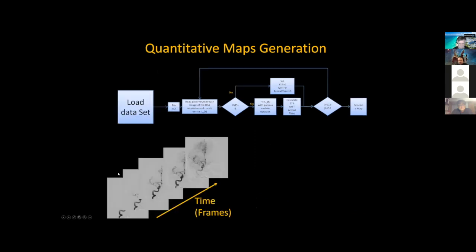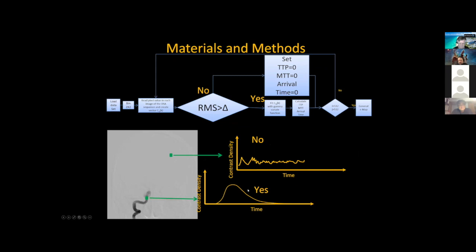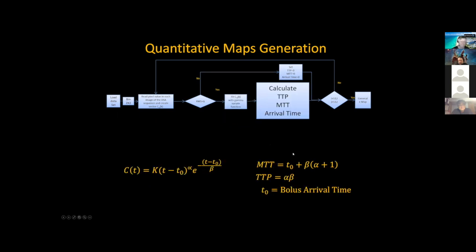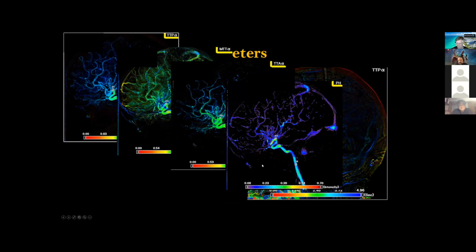And it just goes exactly like in CT. You take the data, you do some processing to make it faster. You look at every single voxel, in this case pixel, derive these kinds of curves, do the analytical function fitting, and derive the parameters, and then do this for every single one in the image, and you get pictures like this. So again, these pictures are the flow seen with different filters, and every single filter gives you a different kind of information.